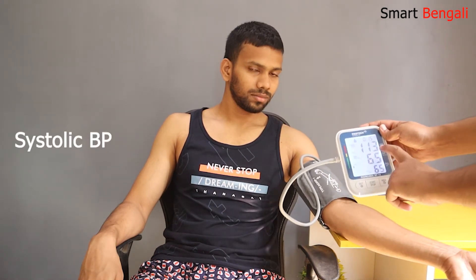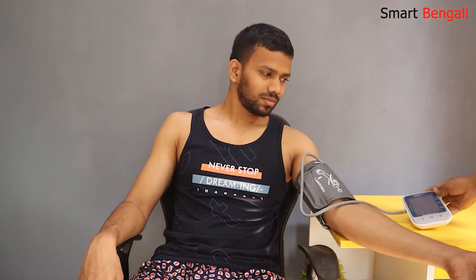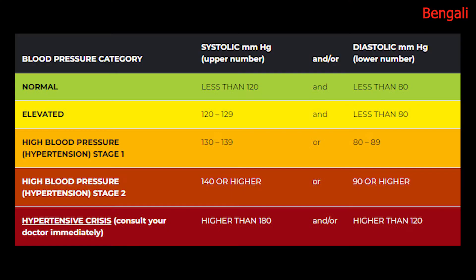The process is done. The reading is 113 over 65. The first number is called systolic blood pressure, which measures the pressure in your arteries when your heart beats. The second number is called diastolic pressure, which measures the pressure in your arteries when your heart rests between beats. His pulse rate is 65 — seems that our friend's heart is doing a good job. For your reference, here's the chart. The values can vary due to many factors like diet, food habit, climate, etc., so it's better to consult a doctor.